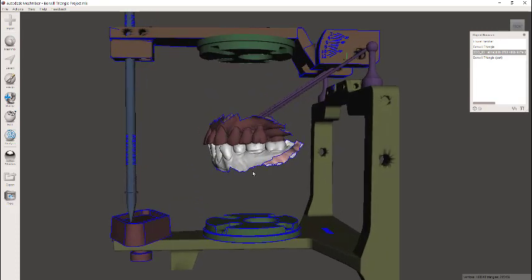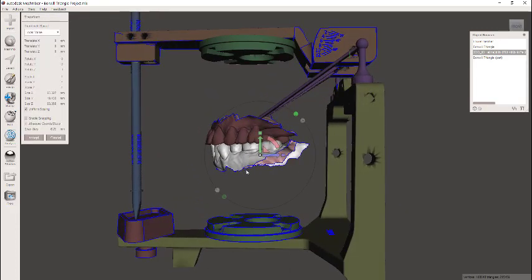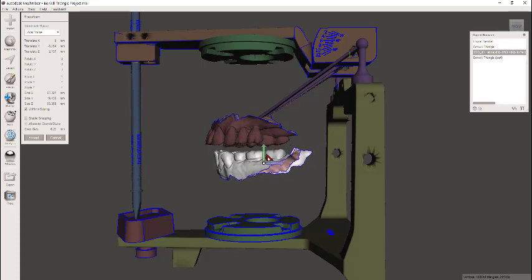So in the digital world, if you tried to just move this, it's not going to work on a hinge motion. Rather, you would be having to just position it in space. You would be having to spin it and try to guess all that. And that makes for a really inaccurate change to the VDO. So we don't want to do that.